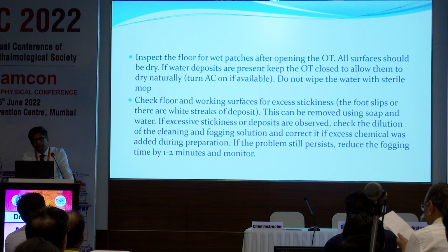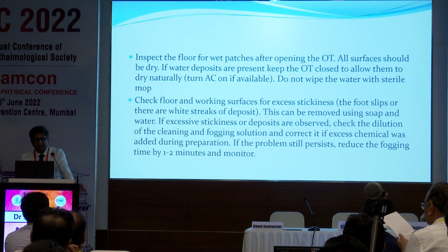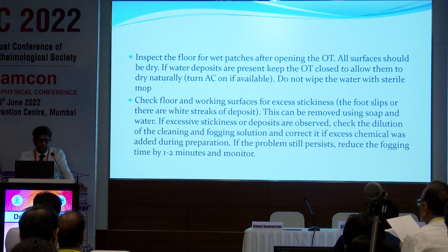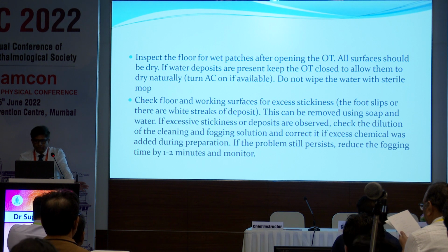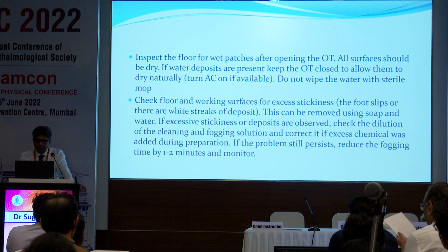Now, once the fogging is done, you have to inspect for any wet patches after opening the OT. If there are any wet patches, don't wipe them, you have to let them dry naturally. And you also have to check whether the working surface has excessive stickiness. If there is excessive stickiness, then you have to check the dilution of the fogging material. And if it still persists, then you can reduce the fogging time by a few minutes.